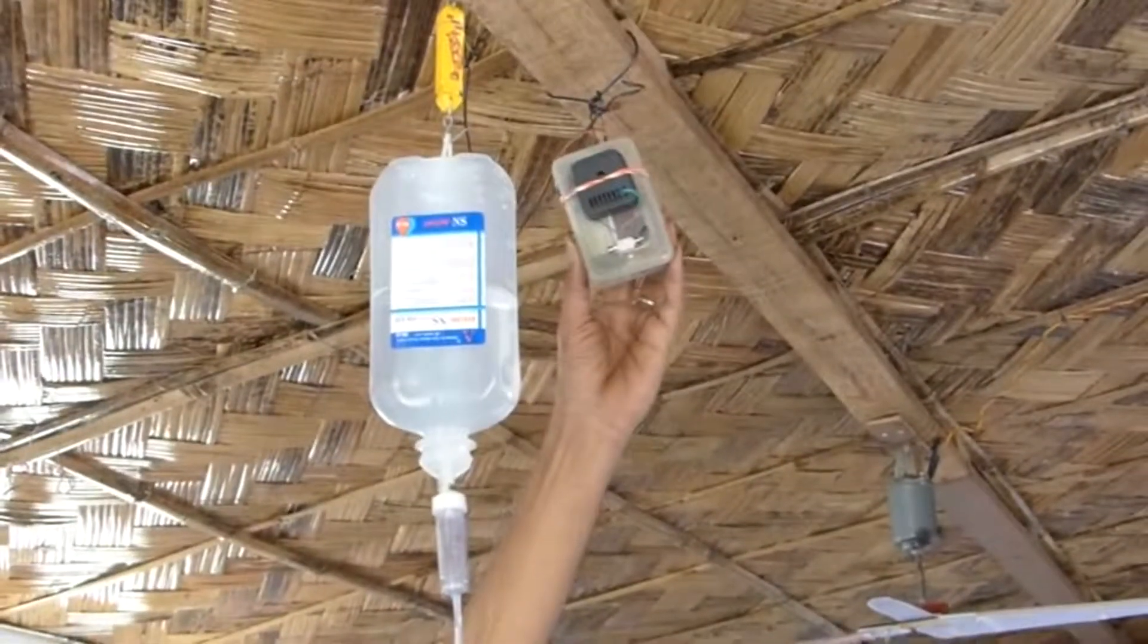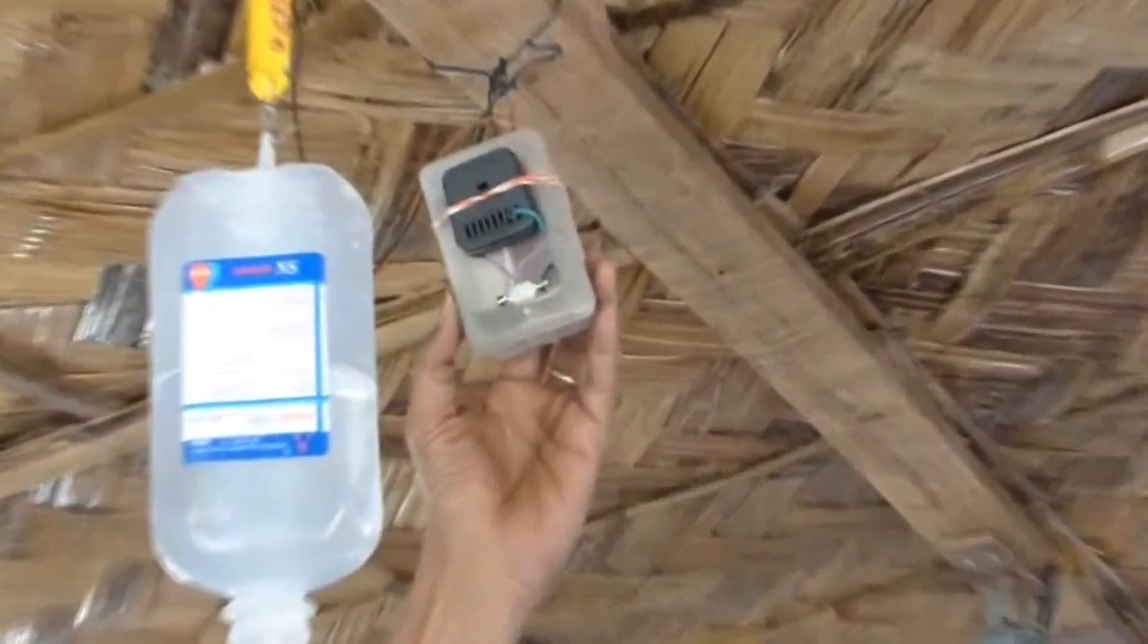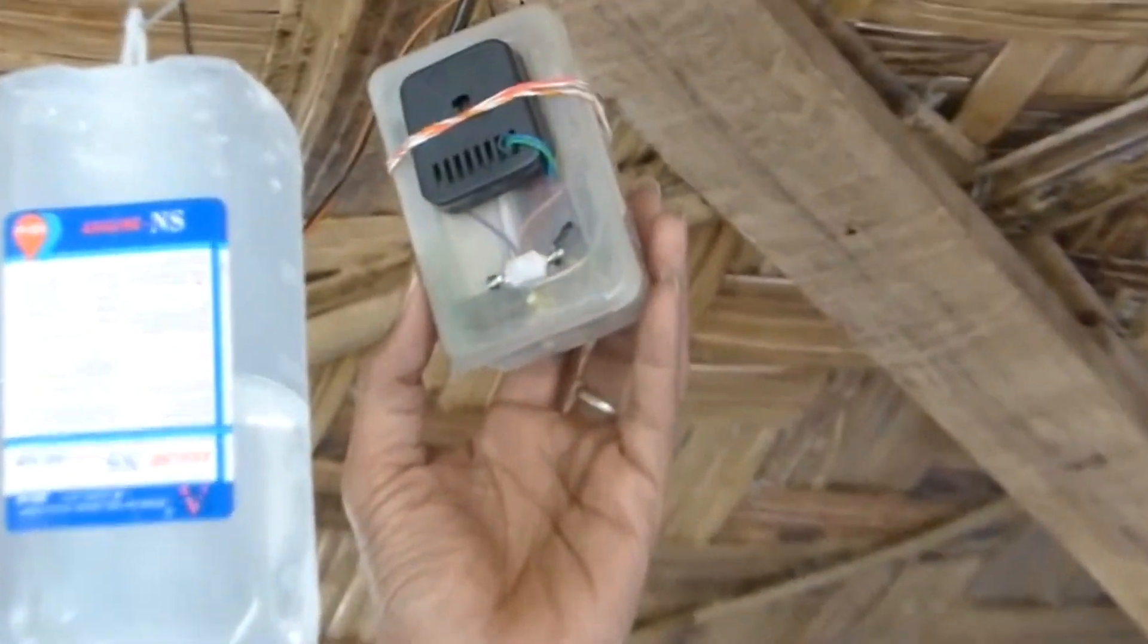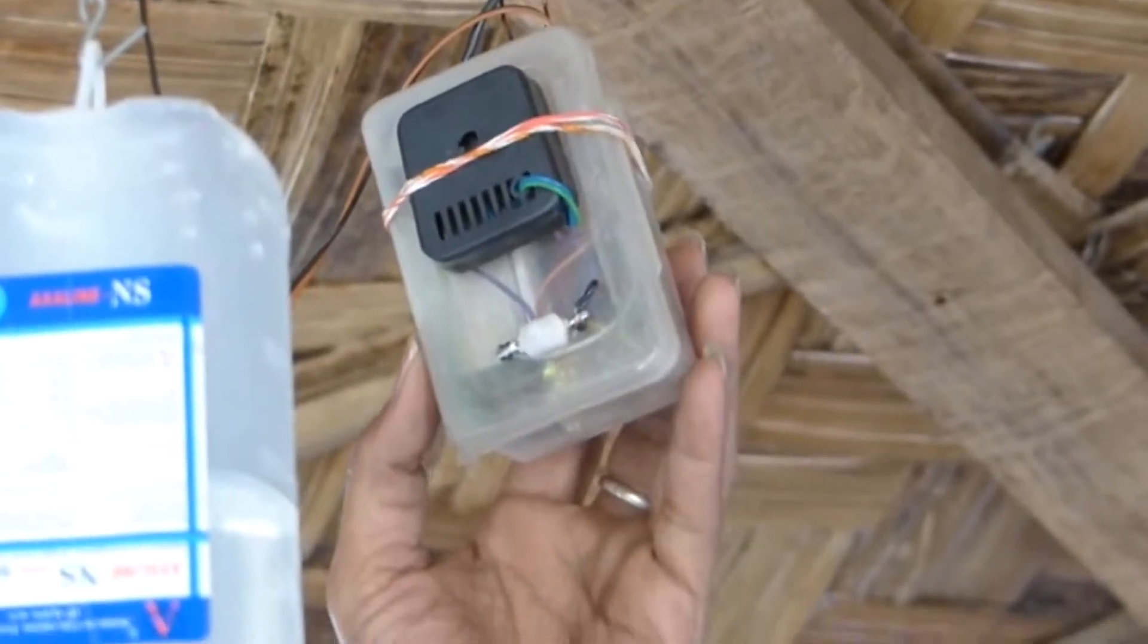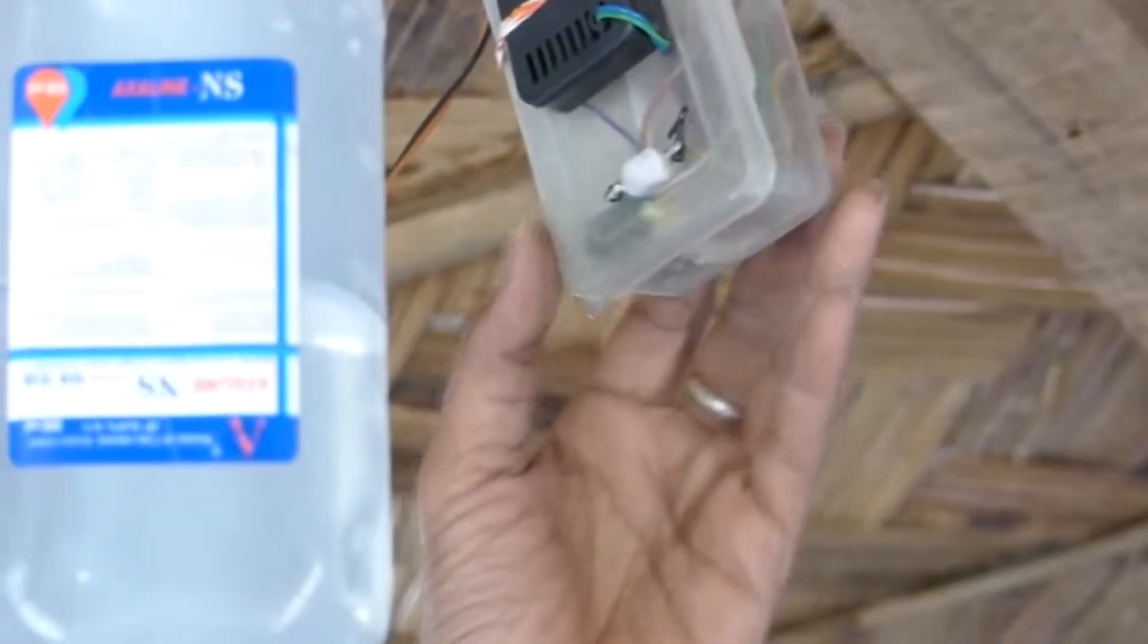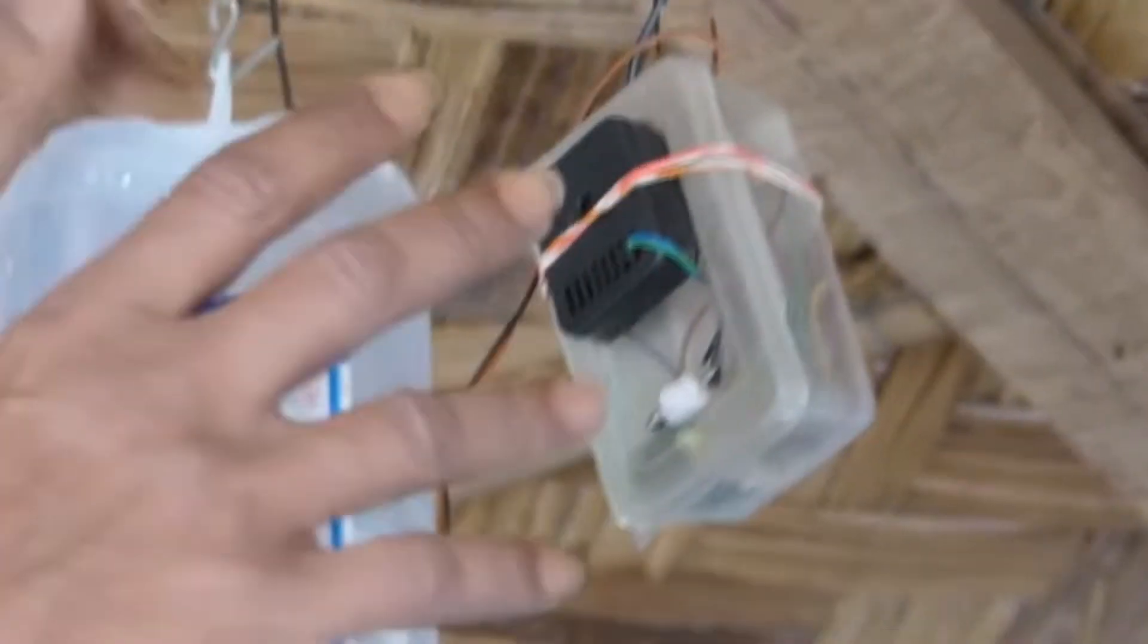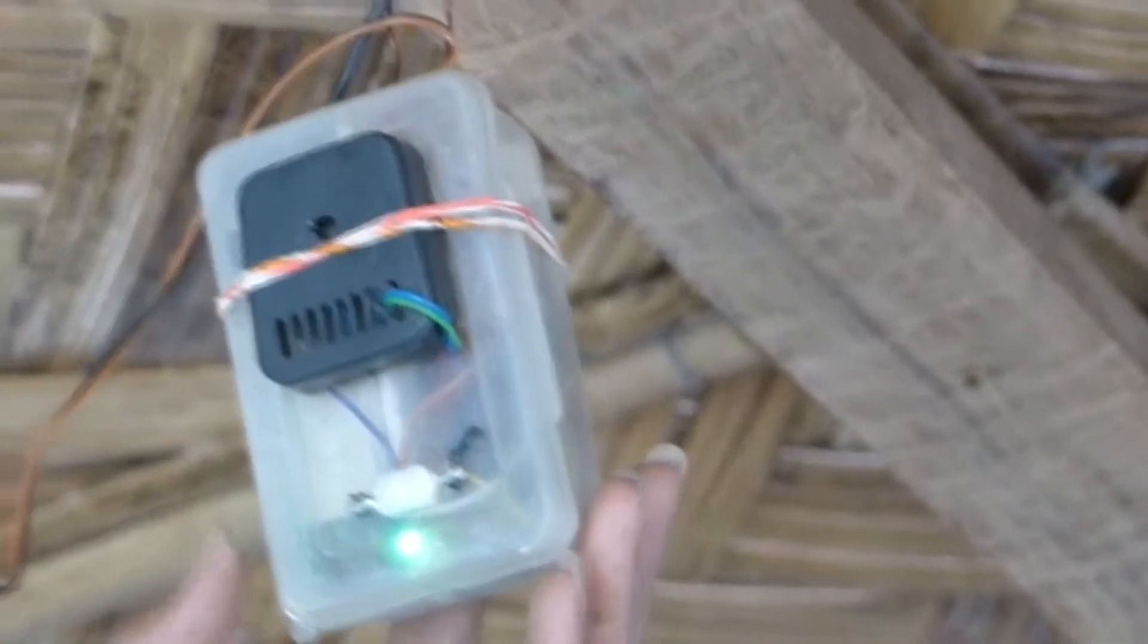Now we are introducing a saline infusion alarm. The alarm is attached here. It's a very low cost alarm which we have designed. This is the normal function of the alarm.